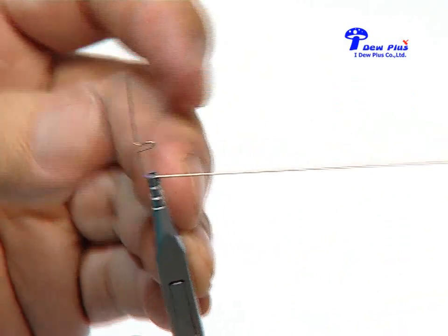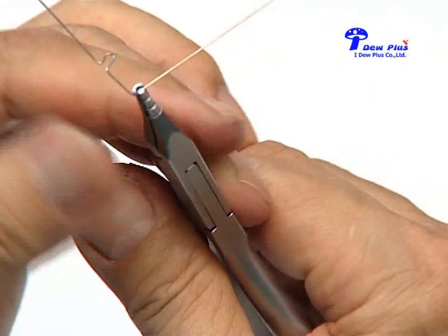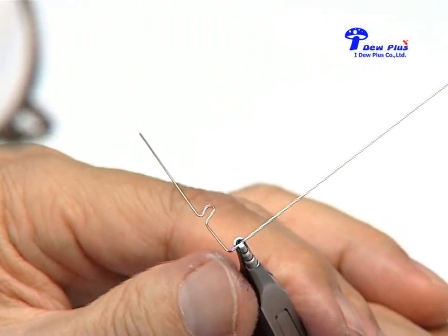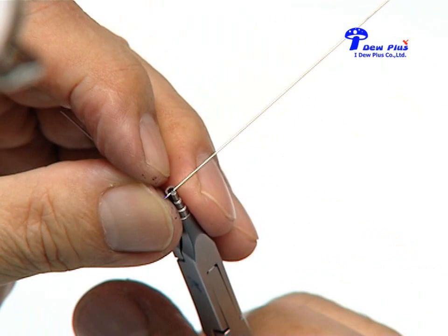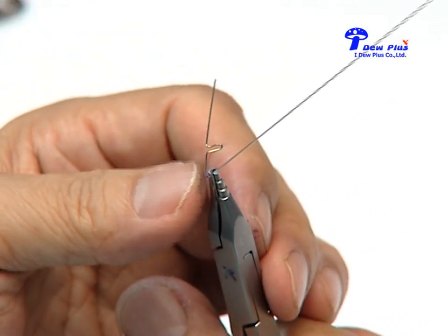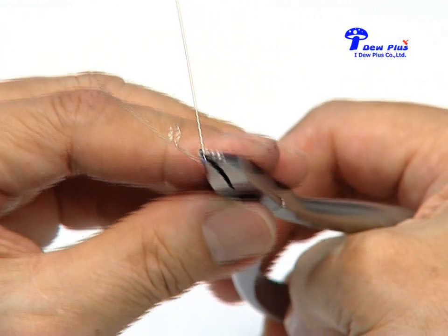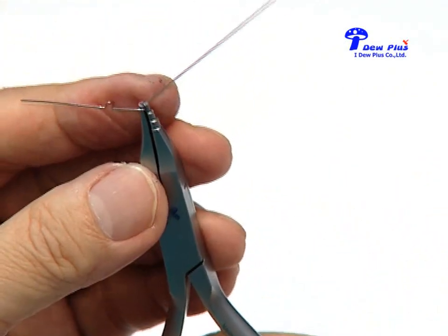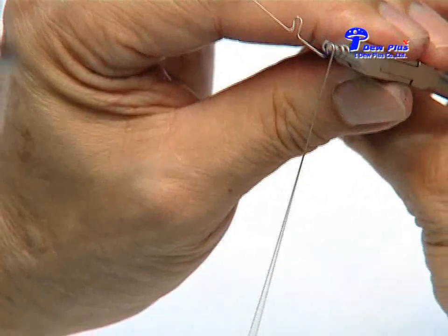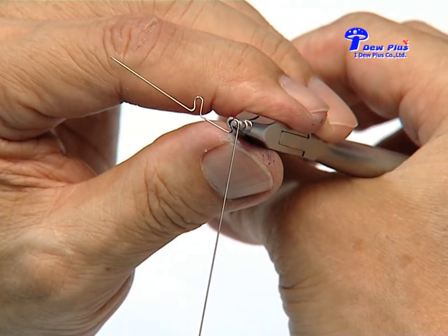Step 1. We bend 90 degrees. You can see now the mesial leg is bent at 90 degrees. Then we slide the arch wire 1 millimeter upward. And we go on pressing until the legs are angulated 45 degrees to each other. Then we squeeze the plier and turn the wire down with the index finger. Now you can see the wire is bent and the leg is 45 degrees down compared to the vertical plane.